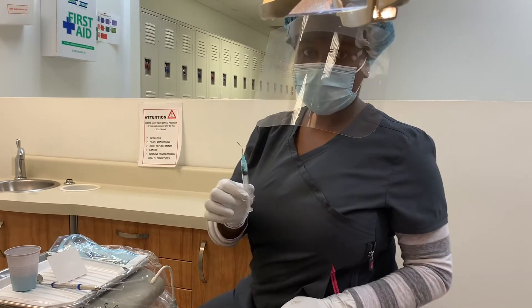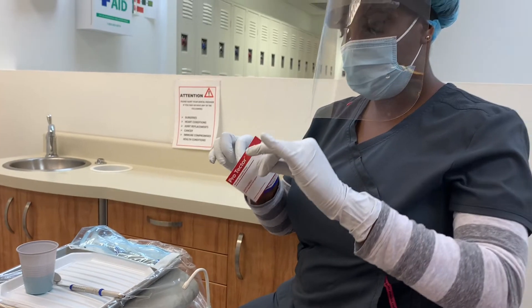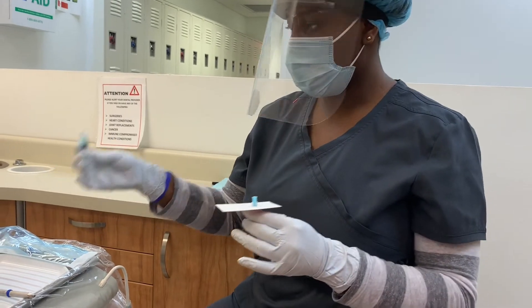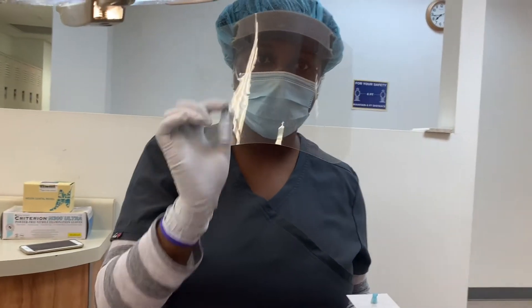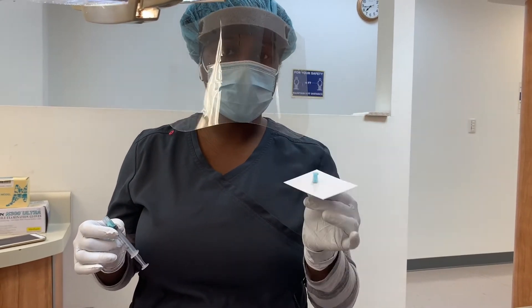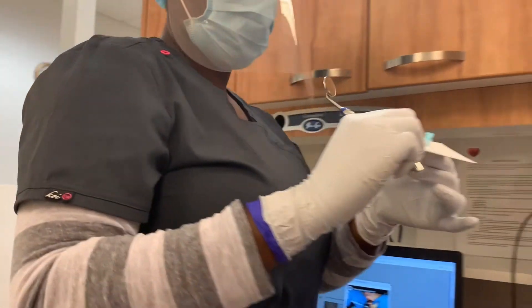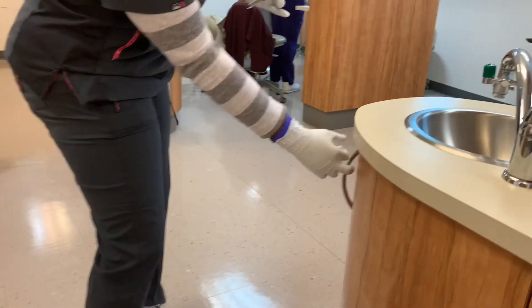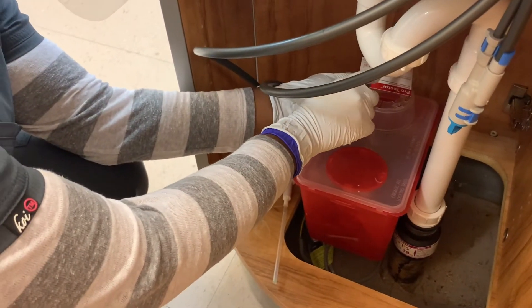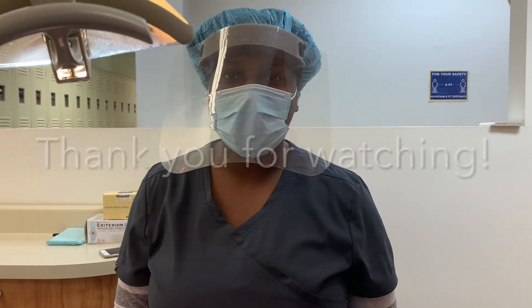For the assembly disposal, I'll use the scoop method for the cannula cap. The syringe I'm going to put in the regular trash, and the cannula will go in the sharps container. I'm going to use my mirror and push the cap down with the mirror until it falls on its own. The protector sheet will go to the top.